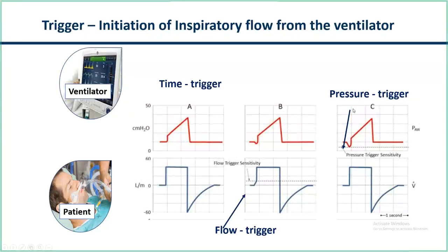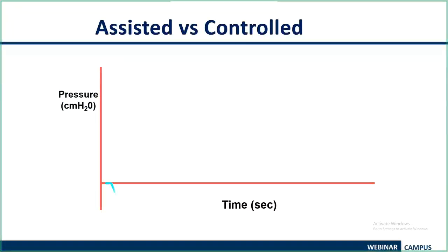If you ask me which is better, when the pressure trigger was introduced initially, it was claimed to be better, but later on the studies have failed to prove any advantage of one method of trigger over the other. So both are equally useful.